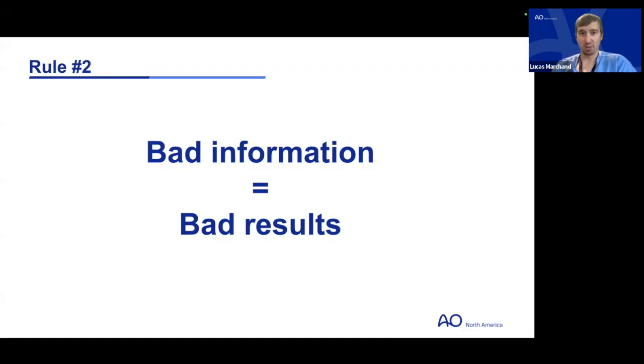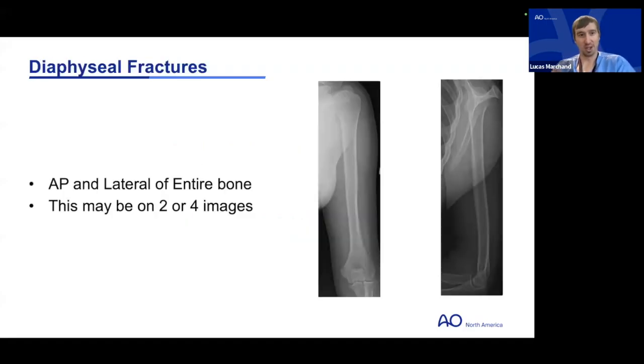And I kind of love the analogy you brought in there about handwriting. That was awesome. So, just briefly, before we get into the four joints that we're trying to really do a deep dive into today, again, the shoulder, elbow, knee, and ankle, I just wanted to bring up for you all the presence of diaphyseal fractures and imaging diaphyseal fractures. So this would typically be when you're ordering images of, say, the humerus or the femur or the tibia. When you do that, you typically are getting two views of that long bone. So on this slide, we see an AP and lateral radiograph of the humerus.